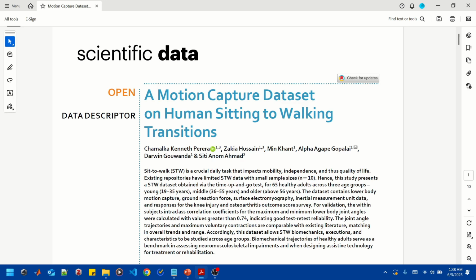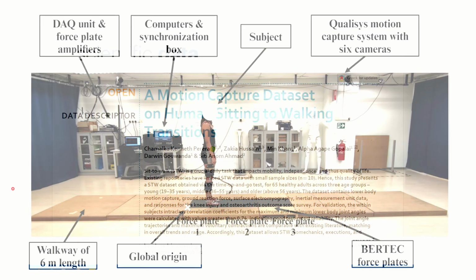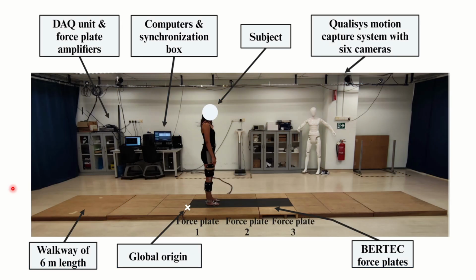And with that, let's get into the 20 general tips. All right, tip number 1, laboratory setup. So this is a snapshot of my laboratory at Monash University in Malaysia. And you would actually have to decide how you would set up your laboratory, how you would utilize the space that's provided to you, how you would allocate the equipment, and where you would place them.